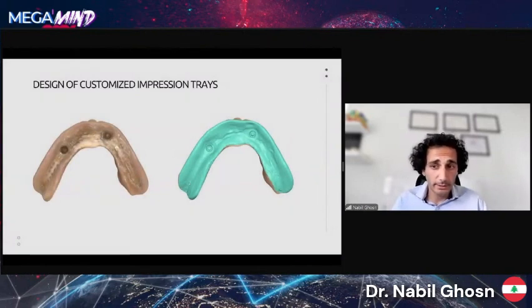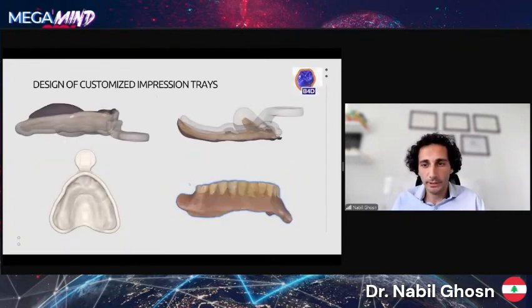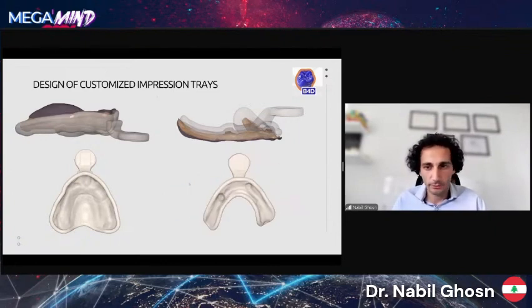Based on this acquired data, we have separated the intaglio surface of the prosthesis and fabricated a customized impression tray using a combination of the Medit Design and the Blender for Dental software.